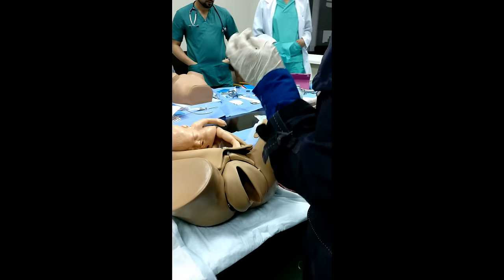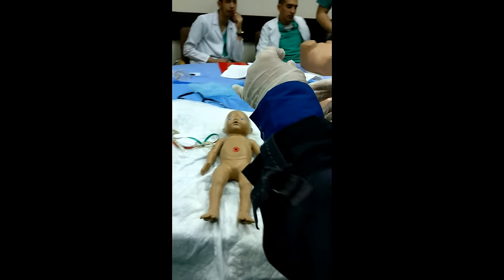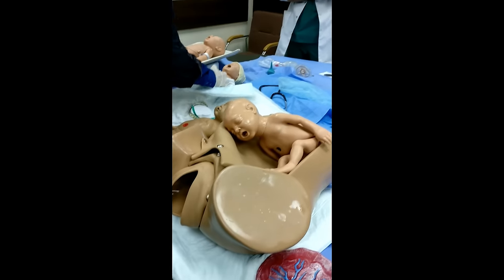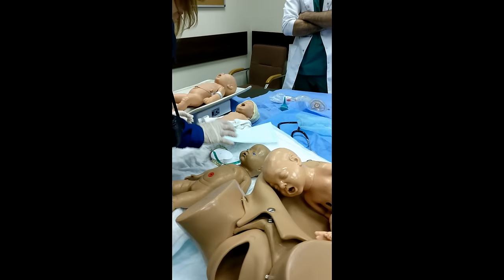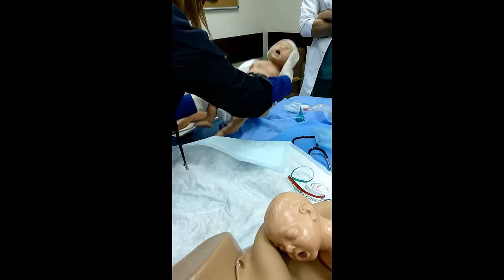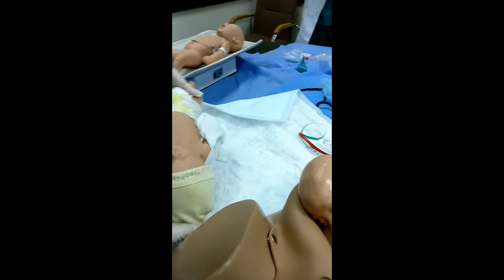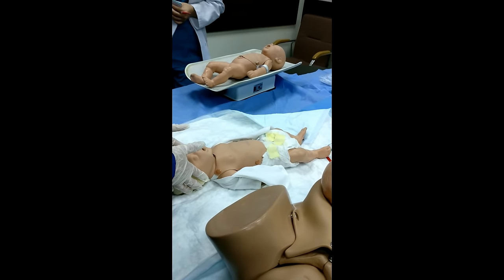Bag ventilation and chest compressions. These are newborns for resuscitation. This is the newborn that is used for resuscitation. You need to place it on a flat surface. To ventilate it, you should be at the head of the newborn, to ventilate.